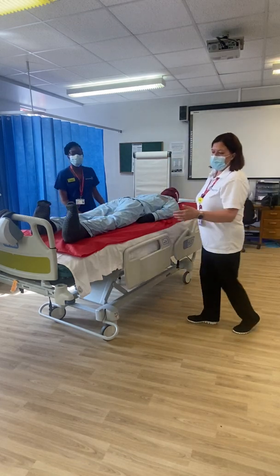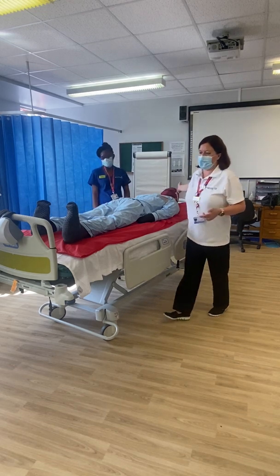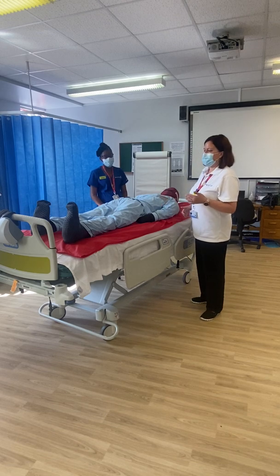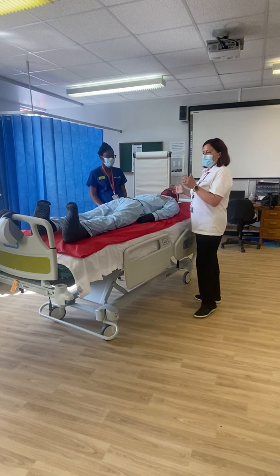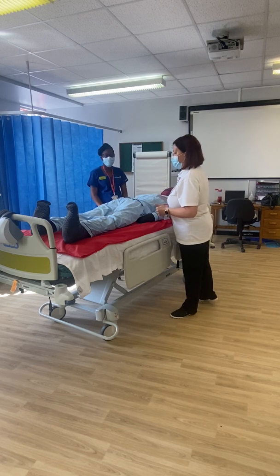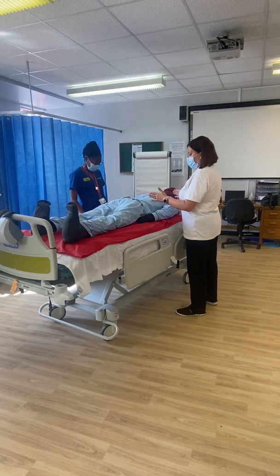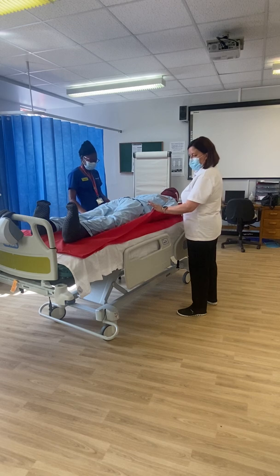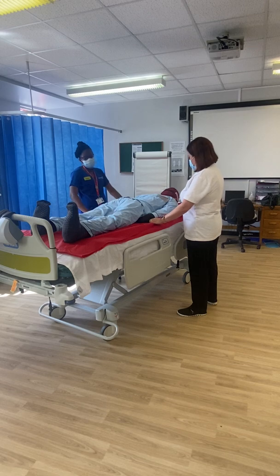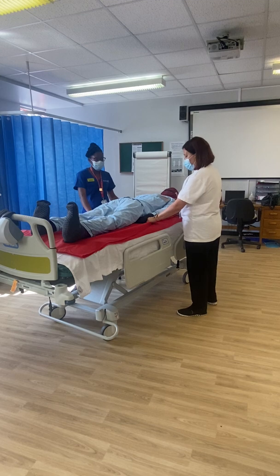So as you can see, the slide sheet is directly under the patient and covers both the head all the way down to the feet. So we can now begin our manoeuvres. Today what we've discovered is that our patient has got too far up the bed, so we're going to manoeuvre them down the bed. So Priscilla and I will face each other at about torso height of the patient. Lift up the top sheet and take a good grip level with the patient's hips and the patient's shoulders. Your hands should be in close to the patient.